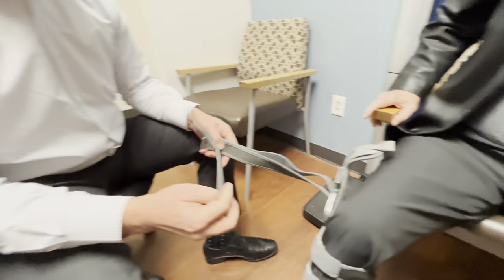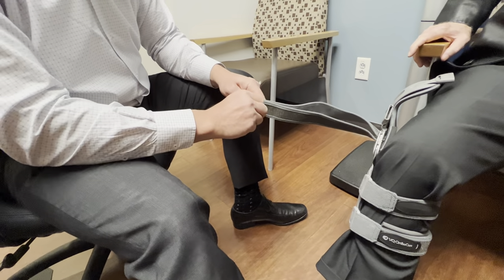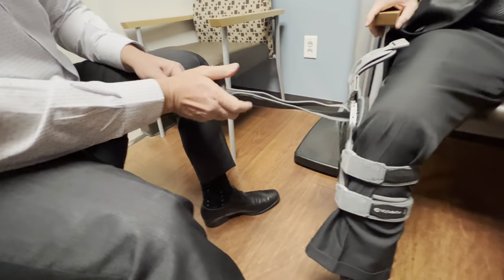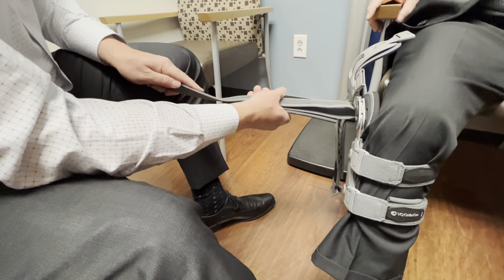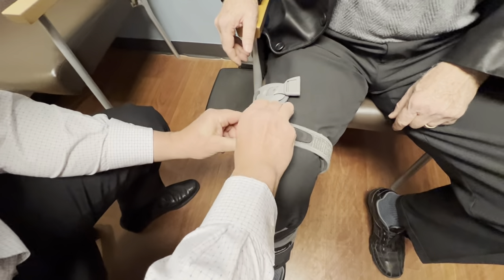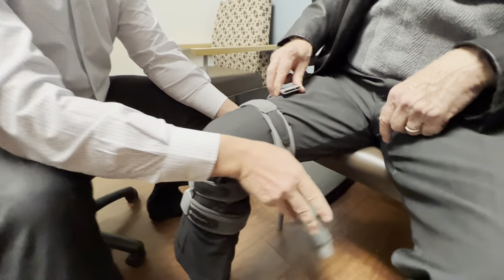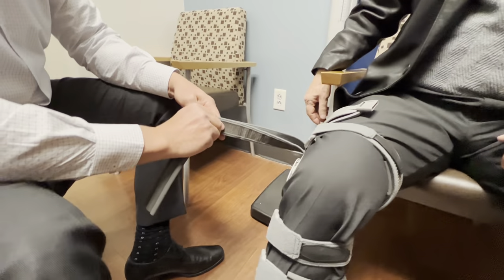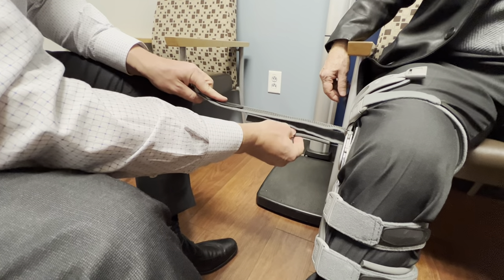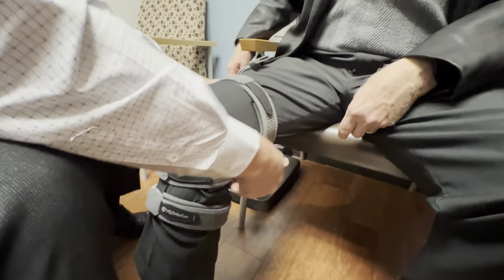So we take this off — this basically prevents the strap from sliding on the leg, gives it a little bit more bulk — just lengthening the strap a little bit, reapply the grip. This is all done by feel; you can do it a number of times and you'll kind of know how far to let it out.